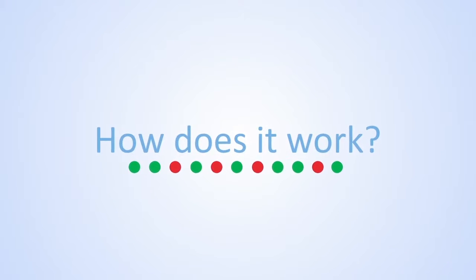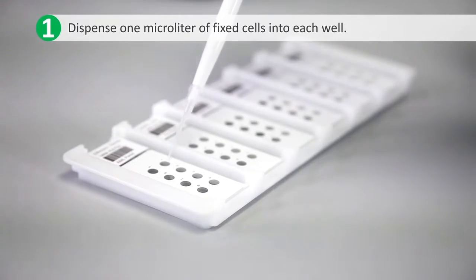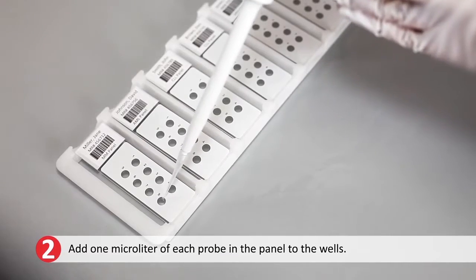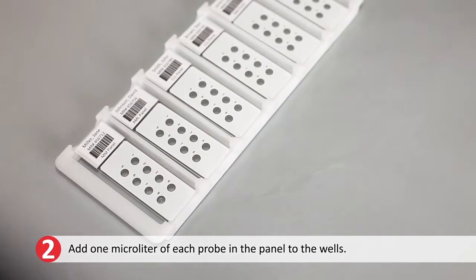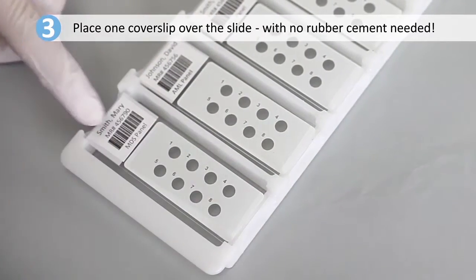How does it work? Dispense one microliter of fixed cells into each well. Add one microliter of each probe in the panel to the wells. Place one cover slip over the slide with no rubber cement needed.